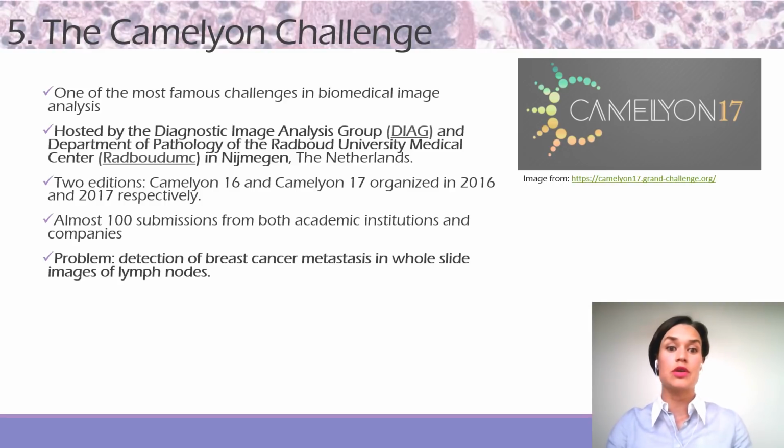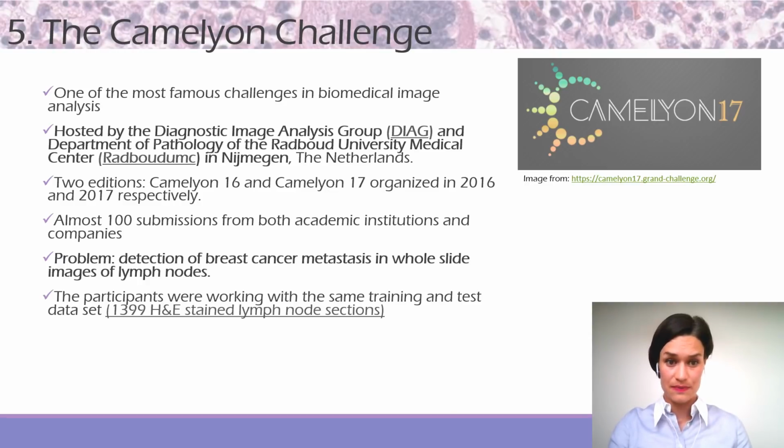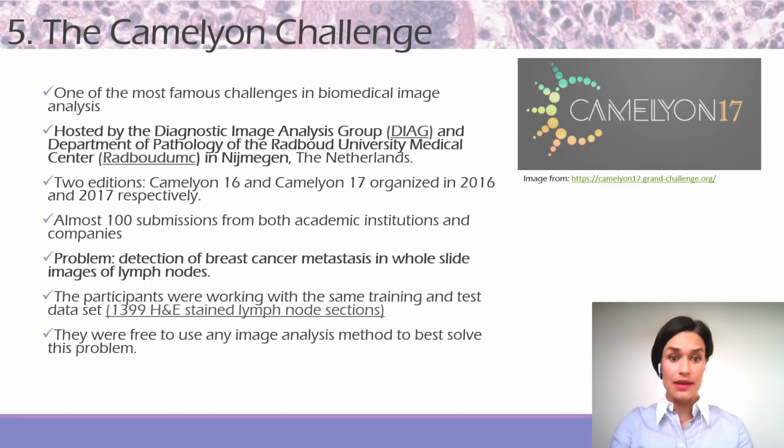The problem here was detection of breast cancer metastasis in whole slide images of lymph nodes. The participants were working with the same training and test set of 1,399 hematoxylin and eosin stained lymph node sections. They were free to use any image analysis method to best solve this problem, so they didn't have to use deep learning. But it just so happened that the winners used deep learning, as it performed the best.